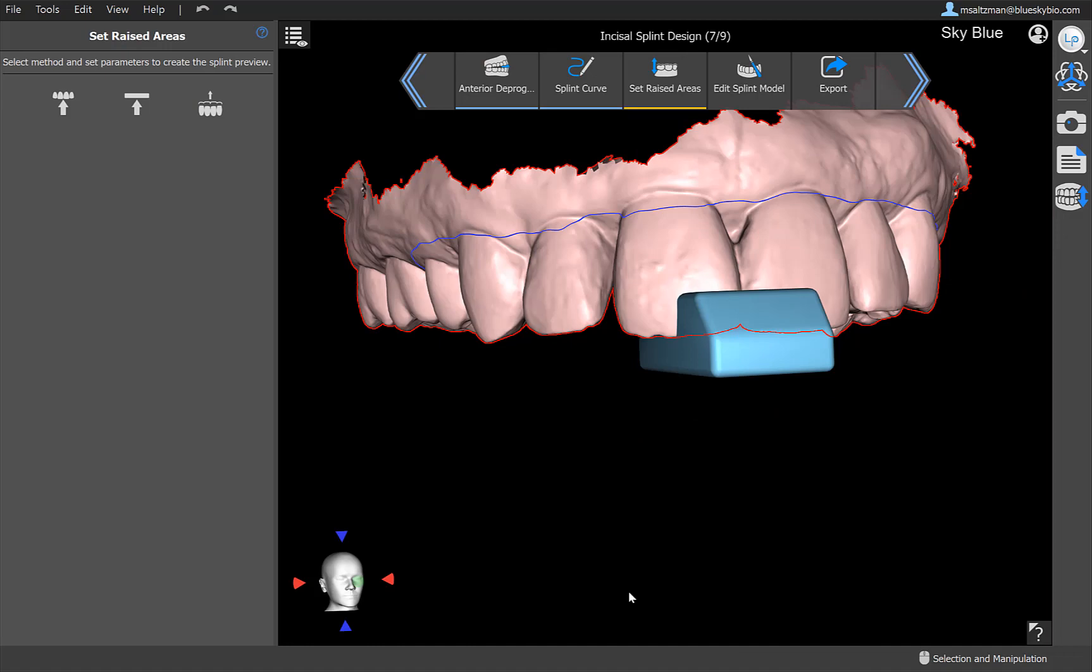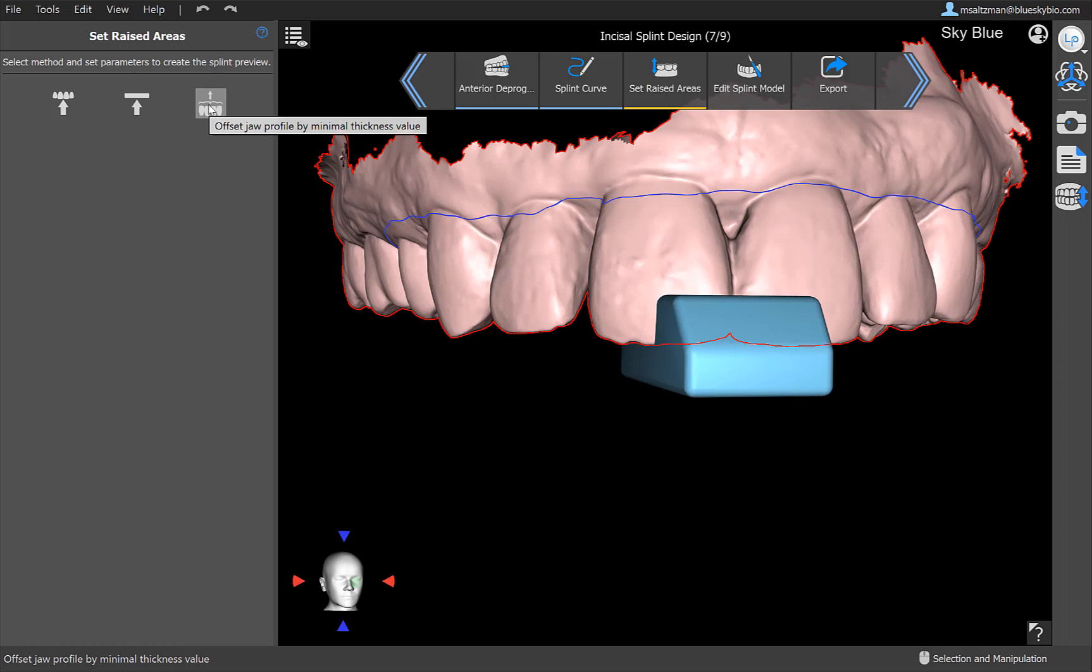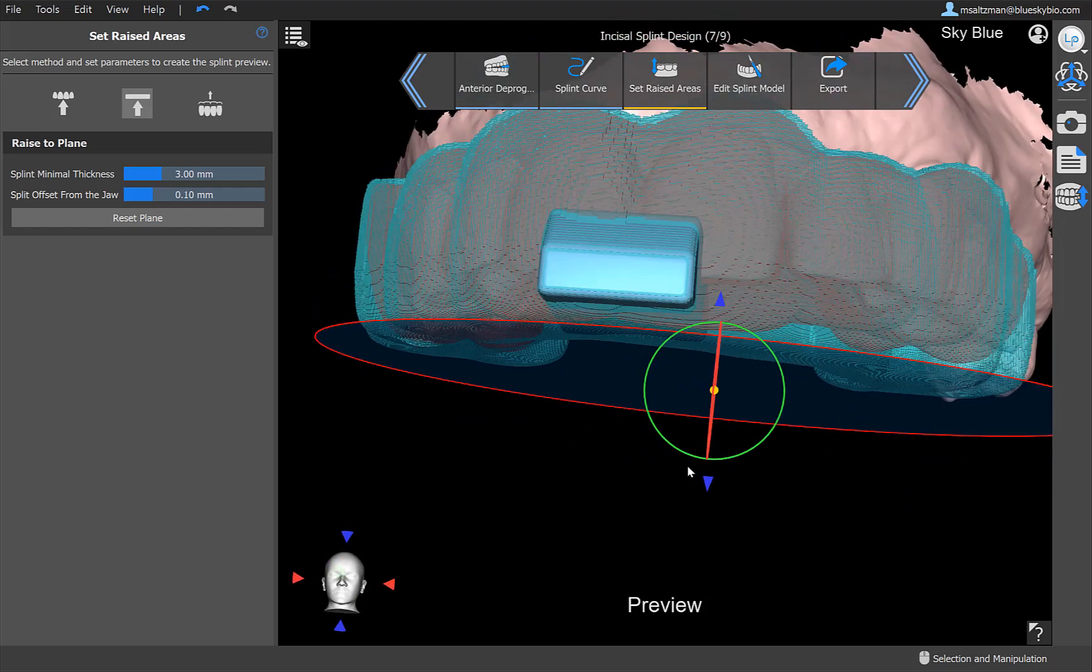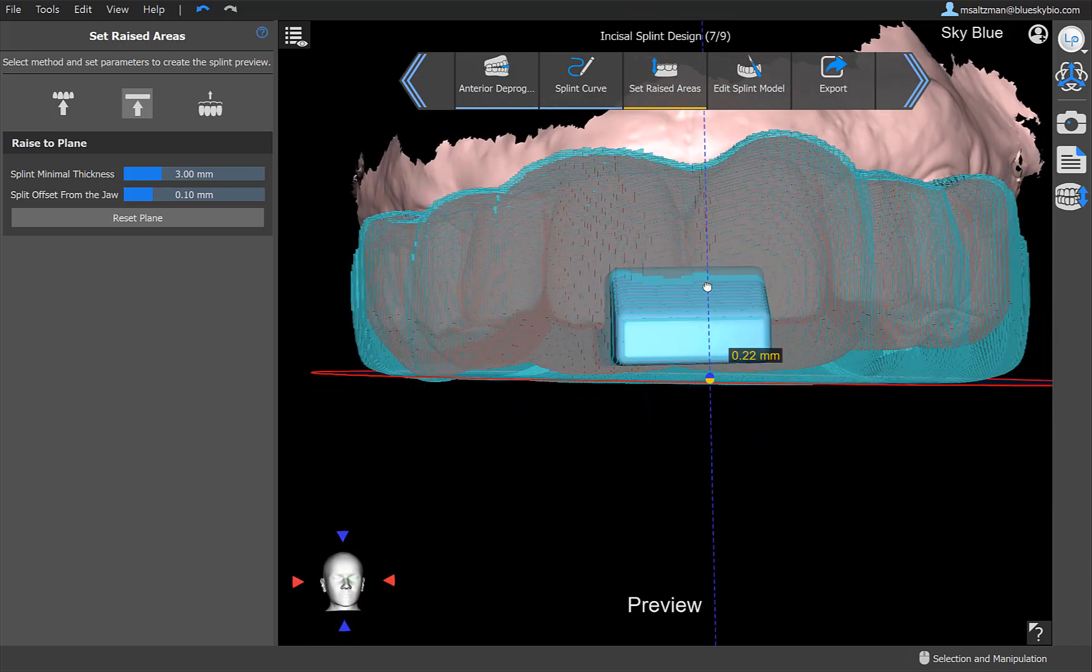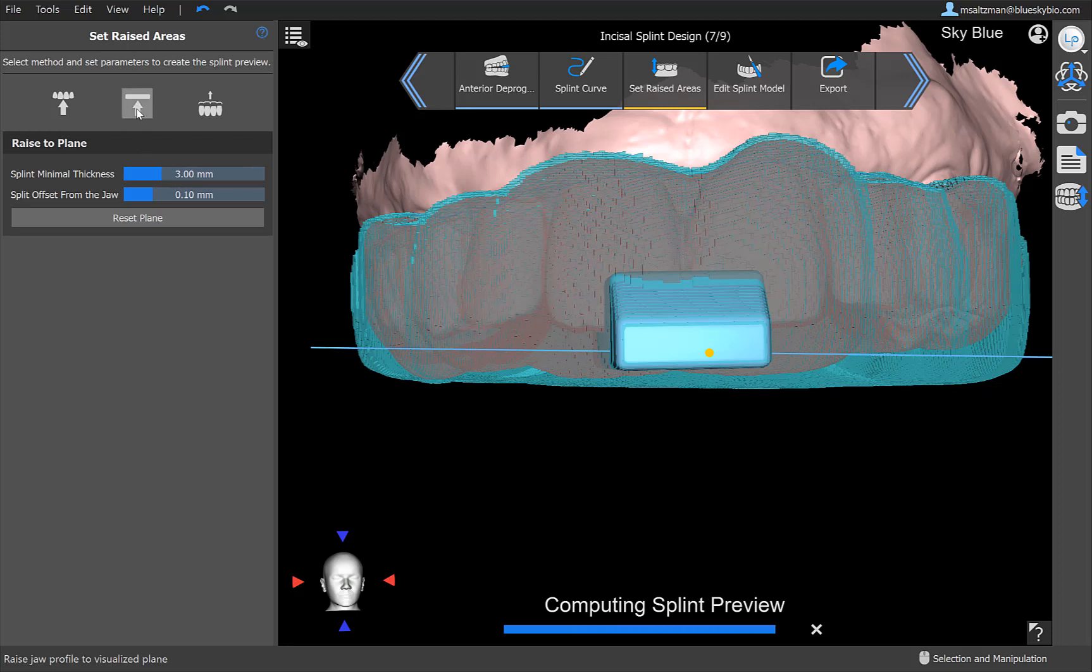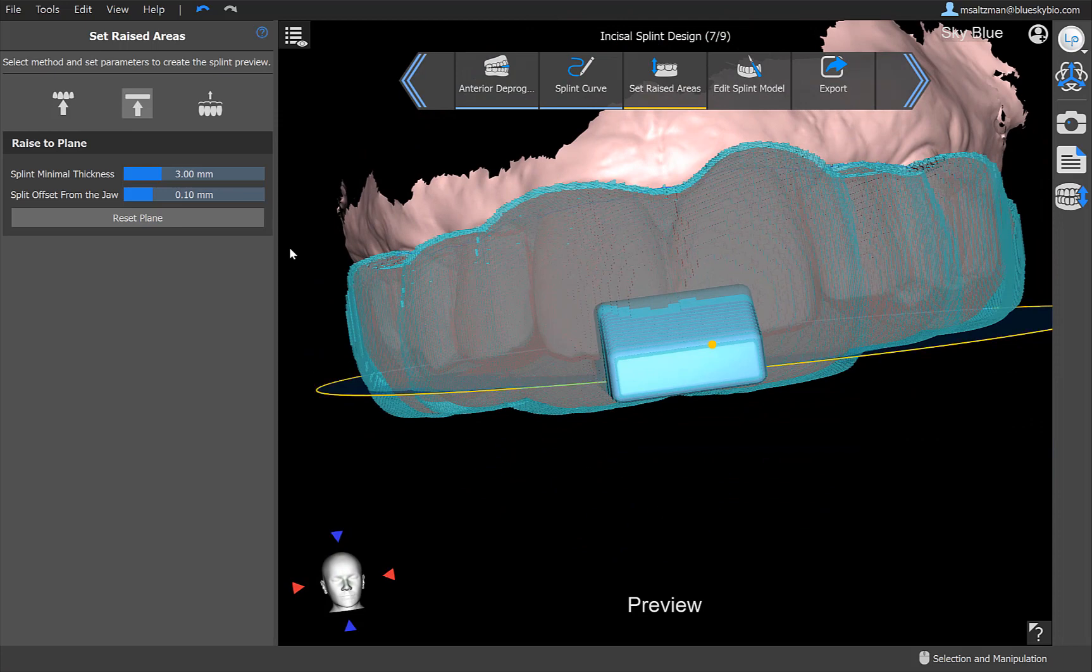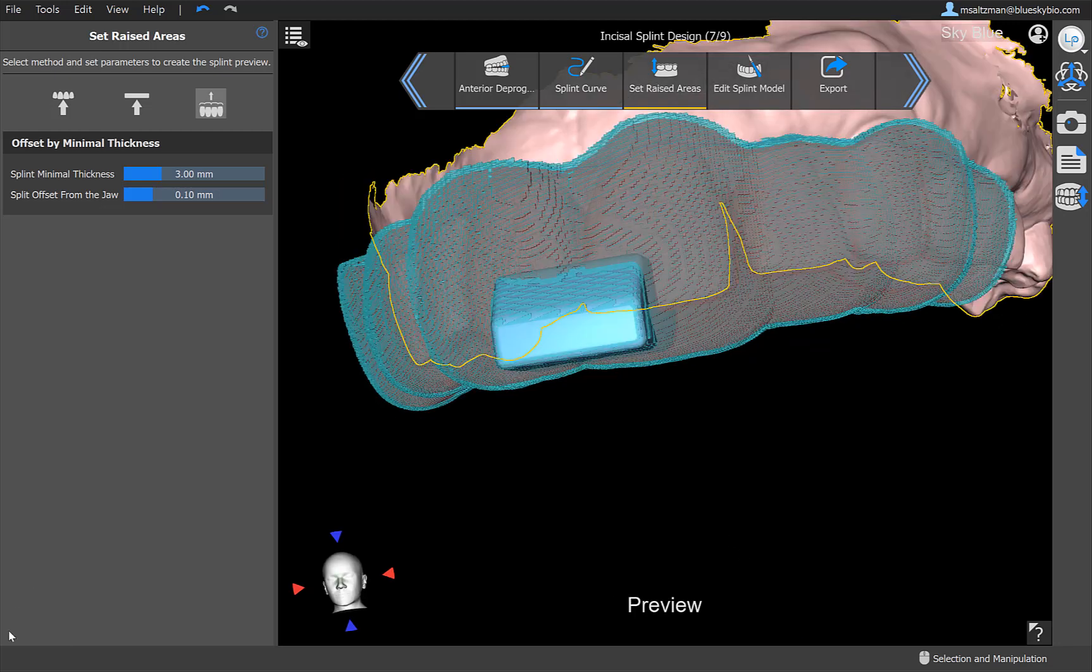There are three ways in the software to define the splint thickness. We have the first option of raising the antagonist cusp tips. We have the second option of raising to a visualized plane and we have the third option of just creating the minimal thickness. So what we've implemented here is the ability to kind of preview or try out your splint in different views. We create a very rough rendering to show you how that will look. What this enables you to do right now is you could go ahead and make modifications in real time and it will regenerate and recompute the preview for you.